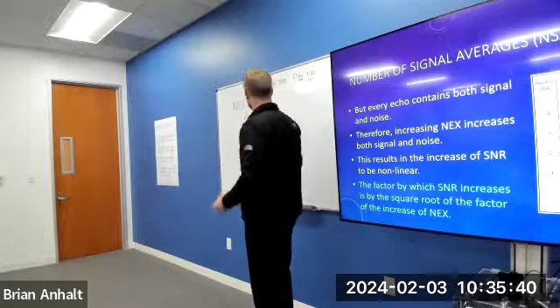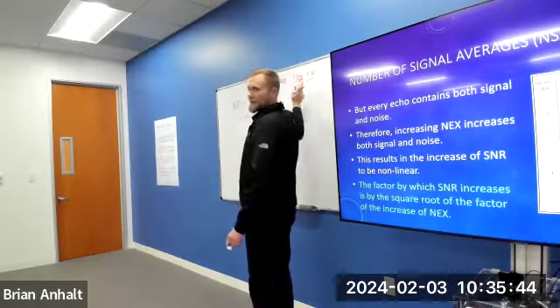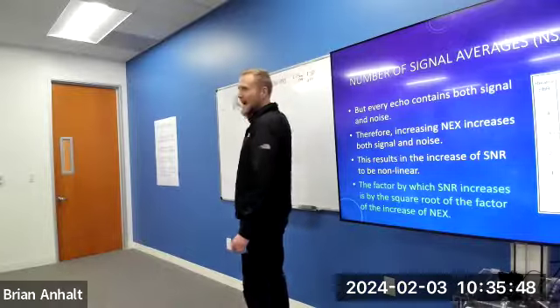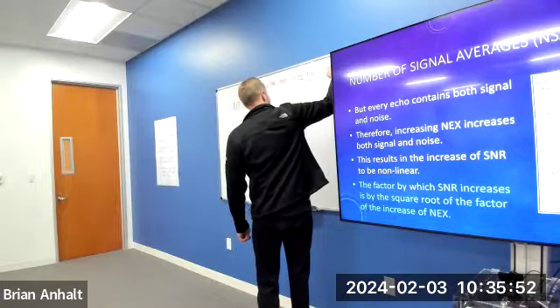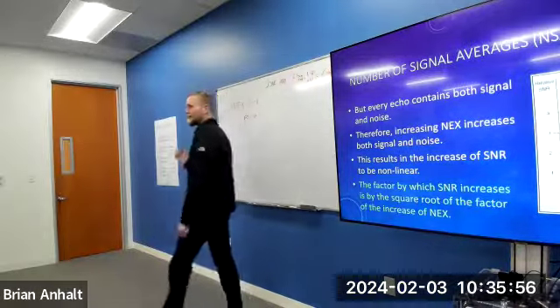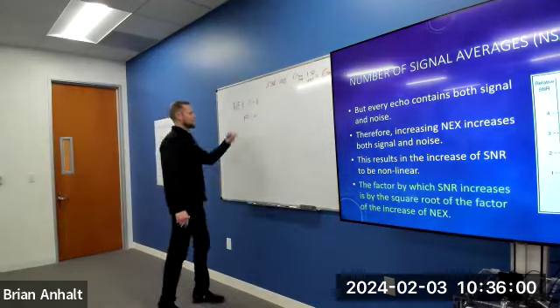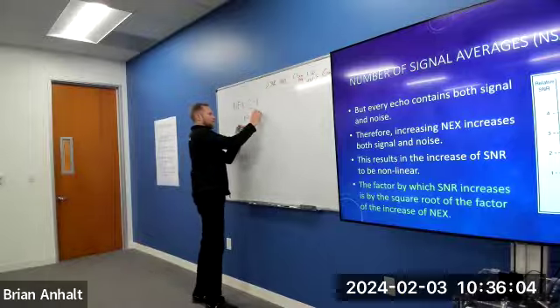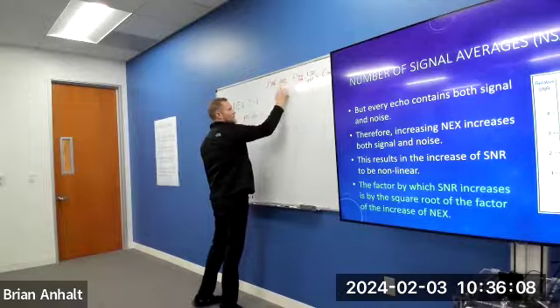6, right? Now, we're not doing 1.3 times 4, we're doing 1.5 because 30 seconds is half of a minute, right? So the scan time now equals 6 minutes. We went from 1 minute 30 seconds to 6 minutes. How much more SNR do we have? How do I figure that out? I take the square root of 4, which equals 2, right? So my new SNR is 200.